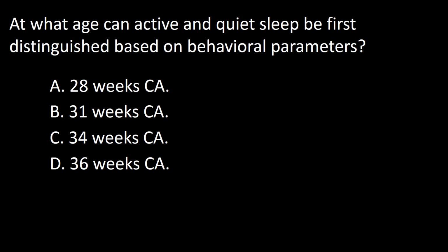So the answer to this question is B. Some authors will not use 31 weeks, but will use 32 weeks as being the better option. But since it is not present in this question, it's really not an issue.